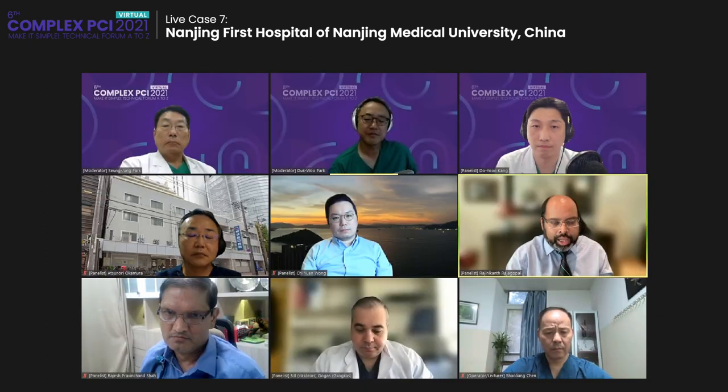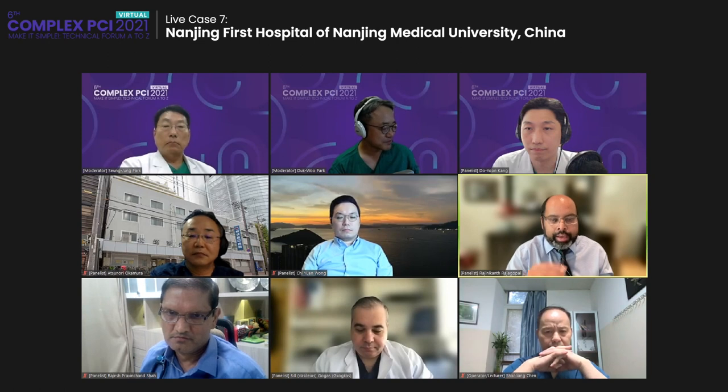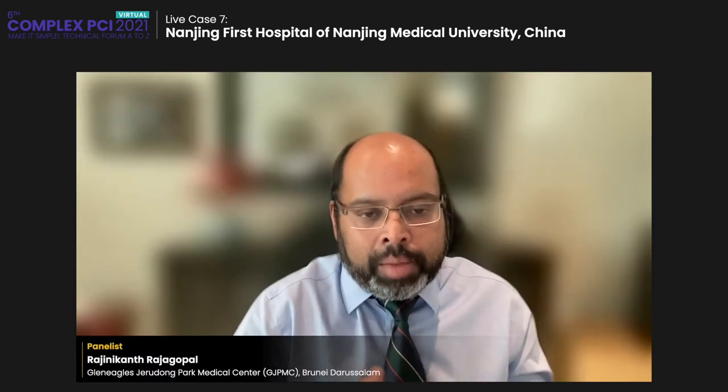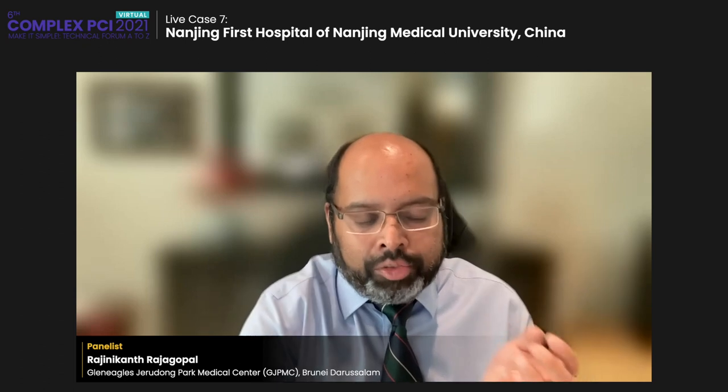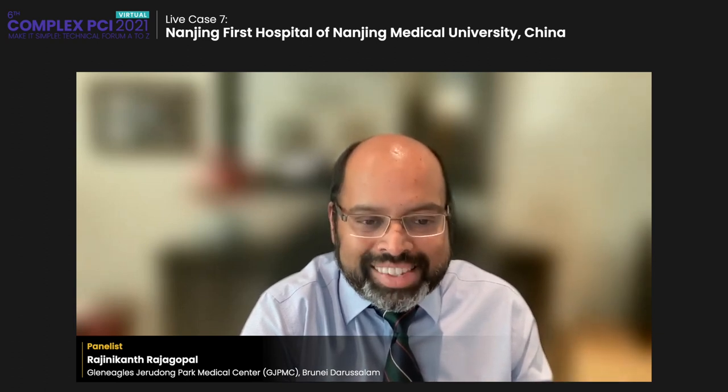So at the beginning, the EBC main protocol recommends aggressive pre-dilatation of the side branch. And after we stent the LAD, we go back and do another kissing balloon dilatation, where we again balloon dilate the side branch. So what we're doing really is POBA in a vessel that is significantly diseased. We're talking about the vessel getting compromised. The fact that the QFR is 0.74 in the beginning means the diagonal is already compromised, and anything more can only make it worse.